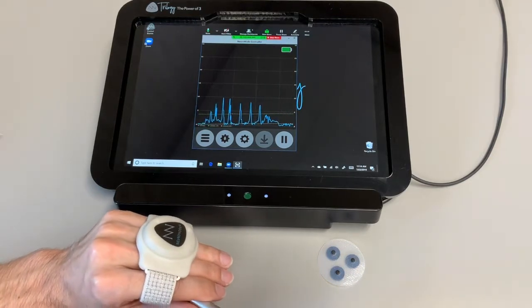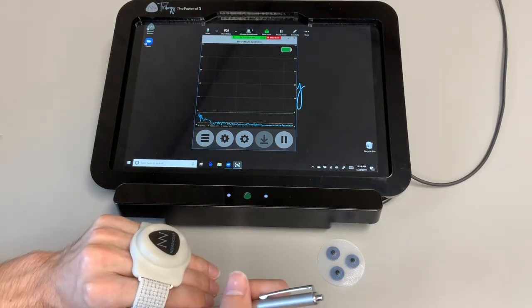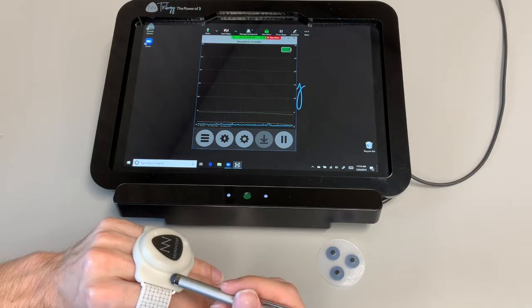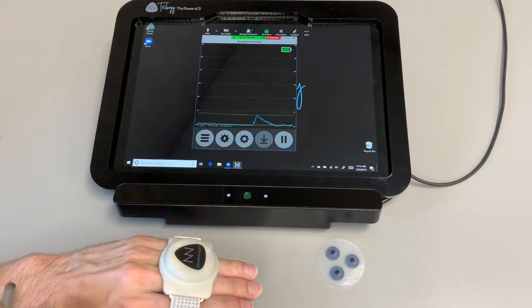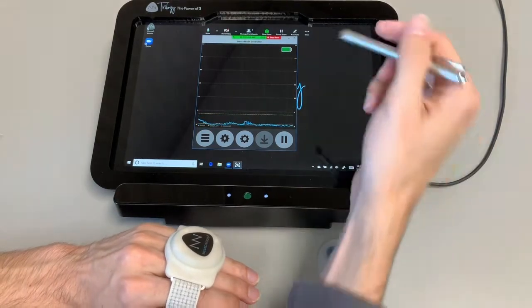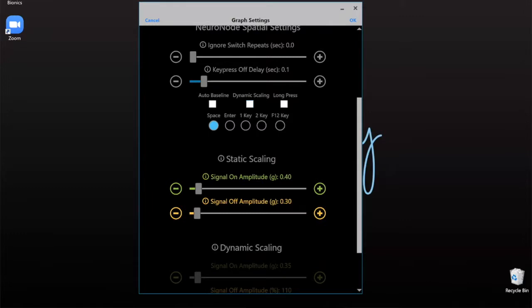But that would be the general rundown for spatial. Again, you're basically looking at this as something where instead of using that EMG signal off of a muscle site, you can attach this to certain places that have some motion, and then track which motion it has from the Neuronode to get a signal in place of that EMG signal. So this could be placed on the end of my hand, on the wrist, or on the tip of the shoe — so if you've got a foot motion, you can do a little bit there. Your dynamic is going to work very similar — you're just going to notice that you've got a G instead of microvolts for the top one, but the way it works is going to be very similar to the EMG. Static is going to be very similar as well, again just looking at that G scaling rather than the microvolts.